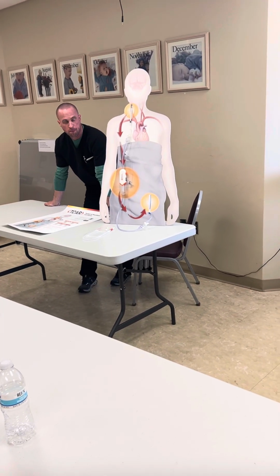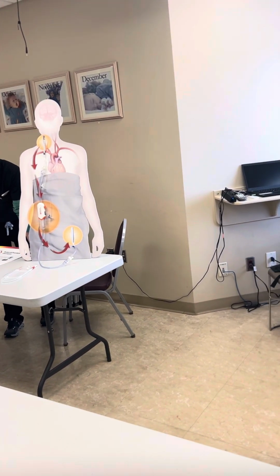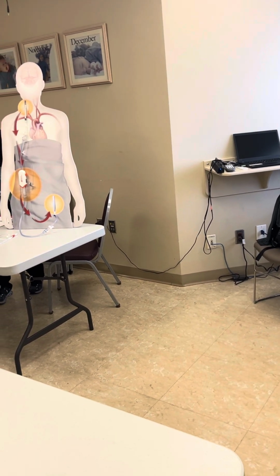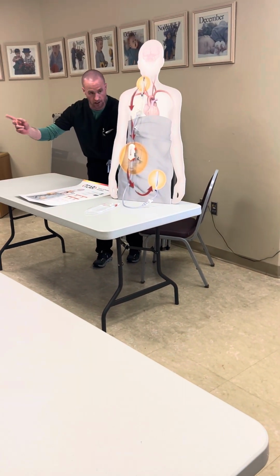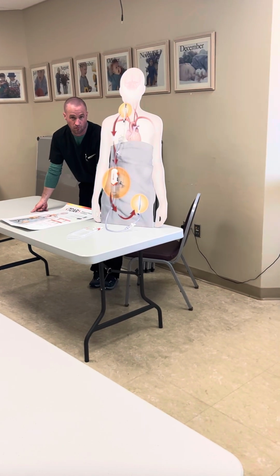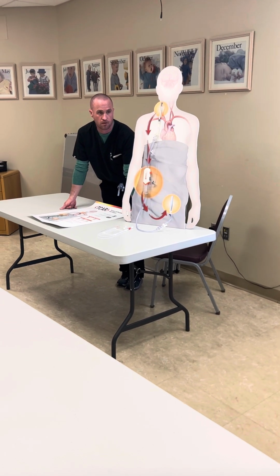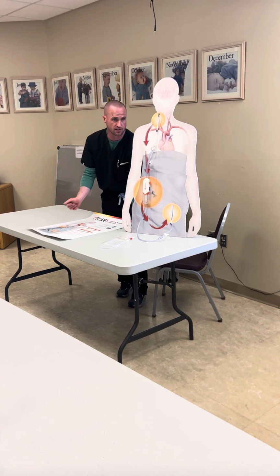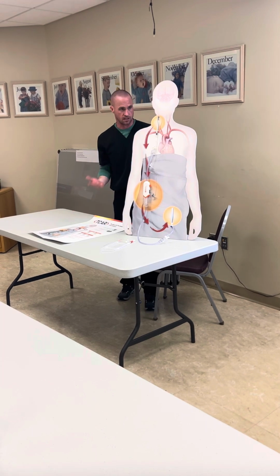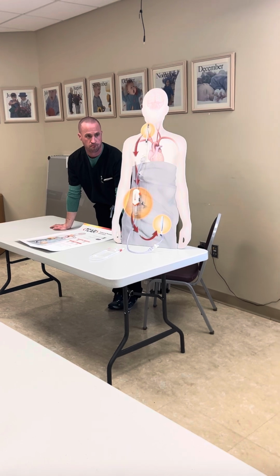Do y'all have any other questions, guys? Hold on, we got a venous question. What was your question? I was just asking about holding pressure on the venous side when we're finished. Most do it during the procedure, like while he's closing, someone's holding pressure, and that way when you want to put the patient on the bed, you just move them over, we're done. It doesn't take a lot, maybe 5 minutes, and they're gonna give protamine as well. So usually it's not bad. Good question. Any other questions?